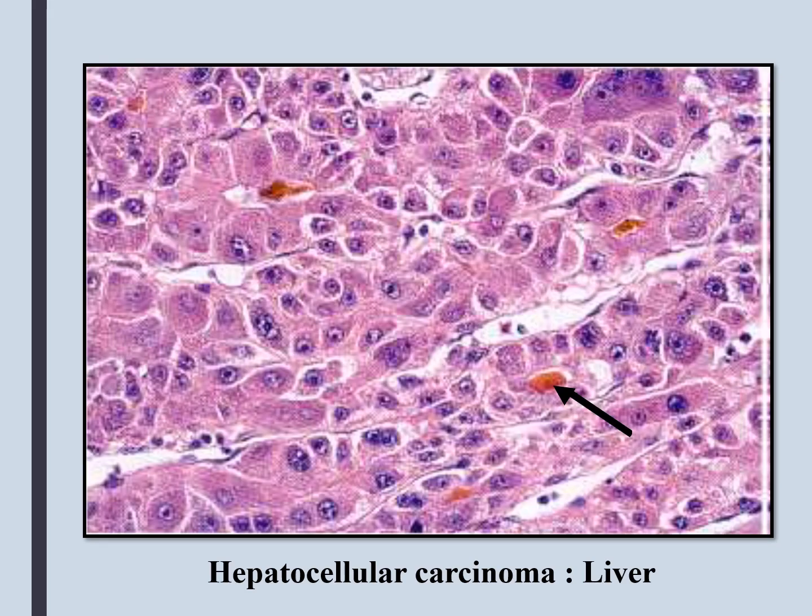Hepatocellular carcinomas range from well-differentiated tumors to highly anaplastic lesions. On microscopical examination, the pattern of growth of hepatocellular carcinomas may be trabecular, pseudoglandular, or in the form of solid sheets. In this slide, the malignant hepatocytes are arranged in the form of trabeculae, showing features of nuclear atypia like pleomorphism and the presence of large hyperchromatic nuclei, with bile production by the tumor cells, which is marked by the black arrow.